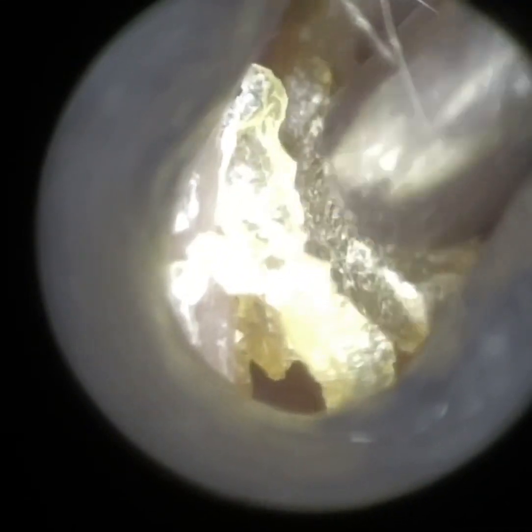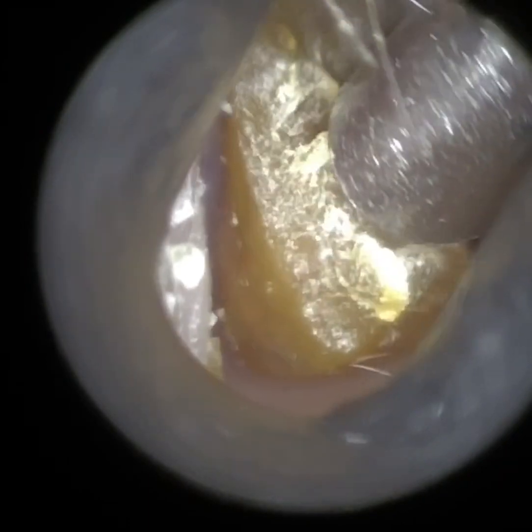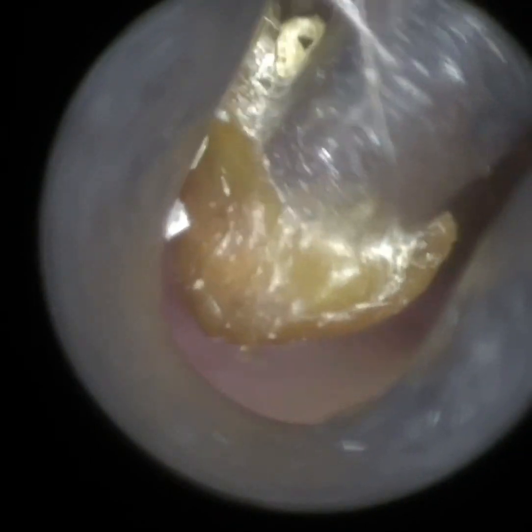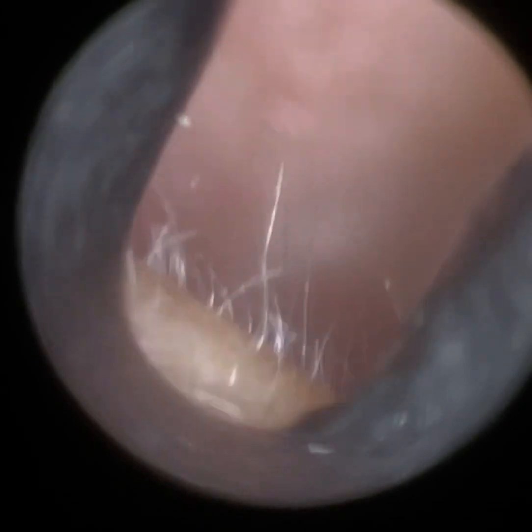We have a patient here who attended with bilateral occlusive earwax — sizeable earwax plugs in both ears — and we're just starting off with the right ear. The patient has got a narrow ear canal entrance, so I'm just using the smallest of our four speculum sizes, which is the 3.5mm. This attaches to the Waxscope directly and of course it's single use, so once used it's disposable and you attach another speculum for your next patient.